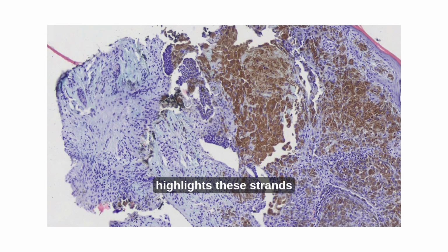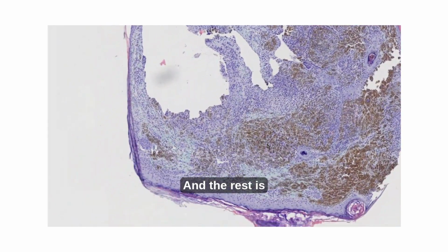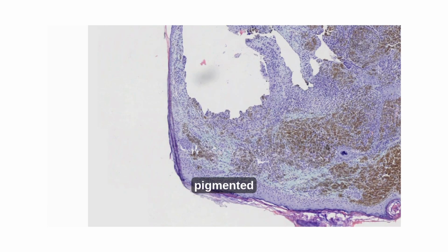It highlights these strands of remnant basal cell carcinoma, and the rest is the pigmented aggregates that we have seen before.